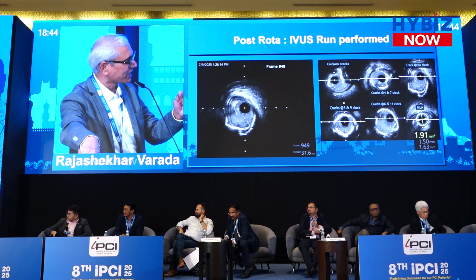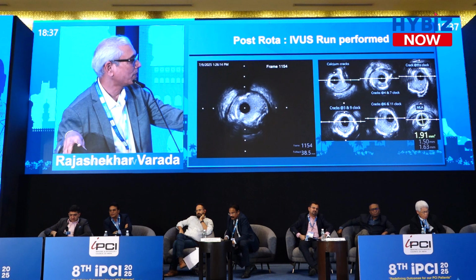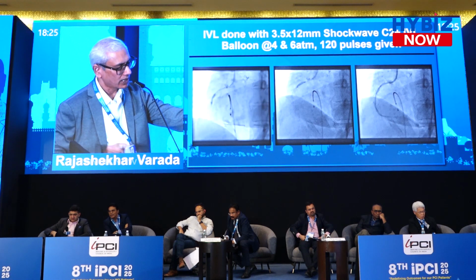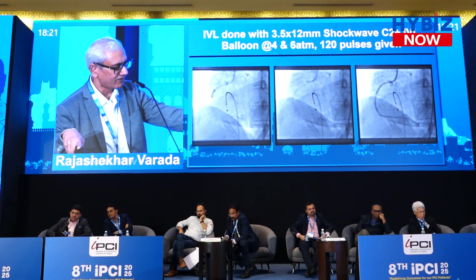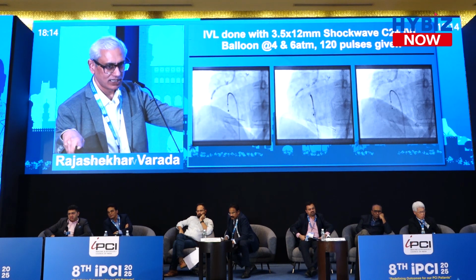Yeah. I think I was also tempted to do the same thing, because I thought we got adequate cracks. But I thought that at some places, there was a 180-degree, more than 180-degree uninterrupted arc. And I also felt that I didn't achieve a very good MLA in some places. So I thought that I would use an IVL now. So you can see with the IVL, there's a significant waist there. And so the proof of the pudding lies in the eating. So now we use the IVL.